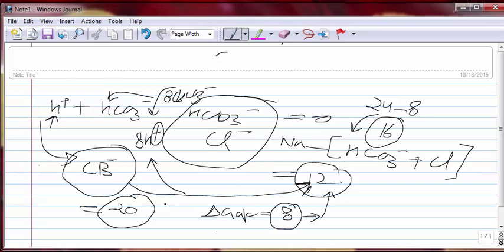So if somebody has an anion gap of 20, that is 8 more than 12, which was normal. So 8 units have released 8 units of protons, which were buffered by 8 bicarb. Your bicarb on the ABG strip should now be 16.